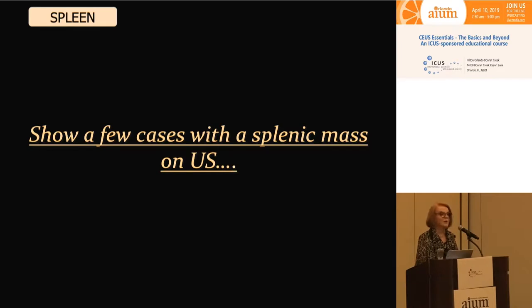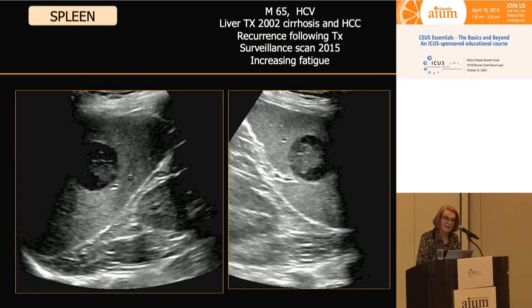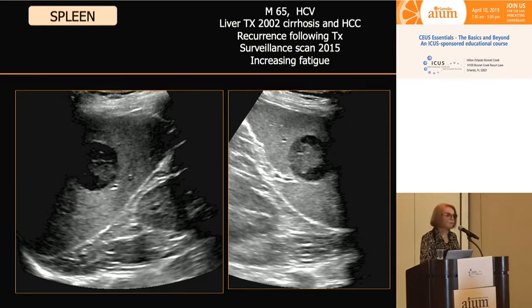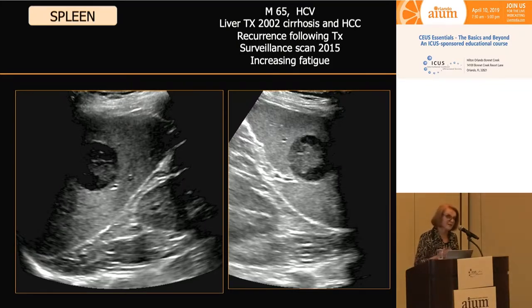Let's start out and look at the spleen. For those of you who are radiologists, you know that splenic imaging on CT, MR, and ultrasound shows a lot of mass lesions. They're often problematic and we often don't get an answer. This really amazing patient was a 65-year-old male with hepatitis C virus who in 2002 had a liver transplant for cirrhosis with a hepatocellular carcinoma.